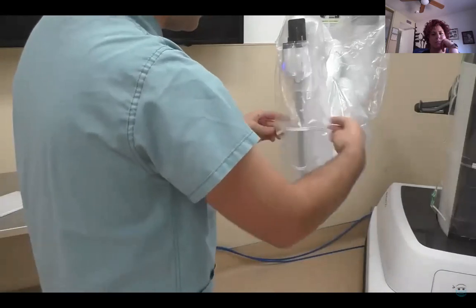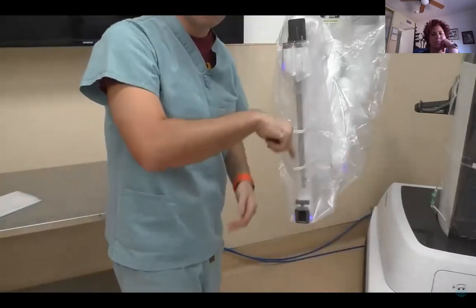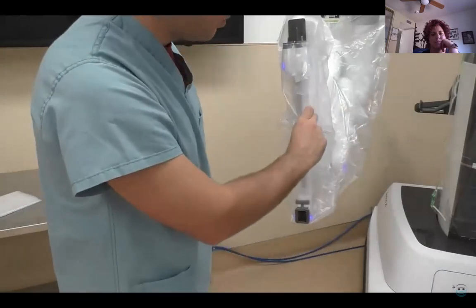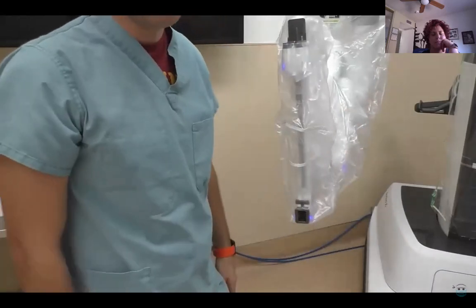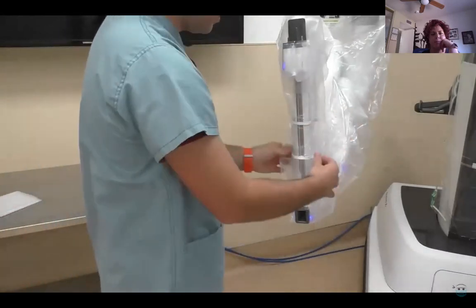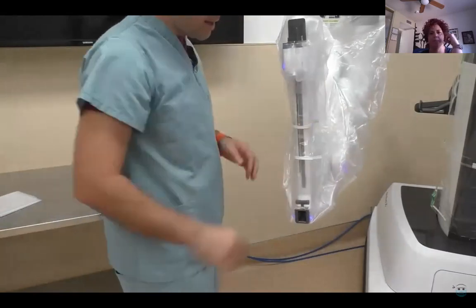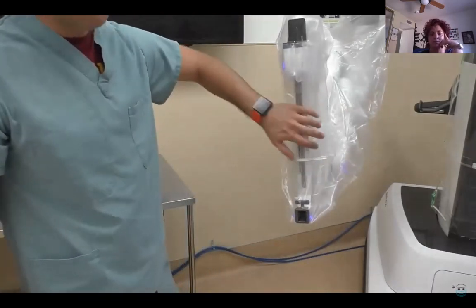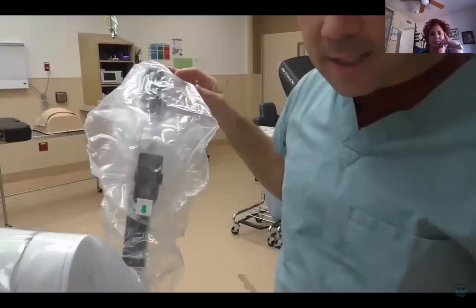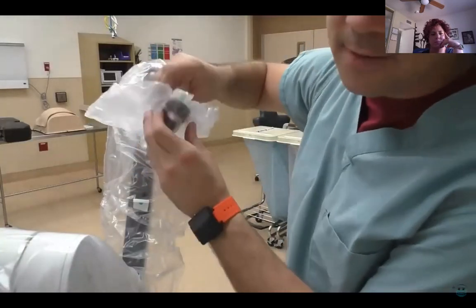If this is out like this, and you go to insert an instrument, you might accidentally puncture this drape and completely contaminate the instrument itself and the case. So take these malleable little plastic pieces and just push them back into the arm to keep that drape out of the way. Last part of this draping is this plastic piece that's on the back side of the drape.